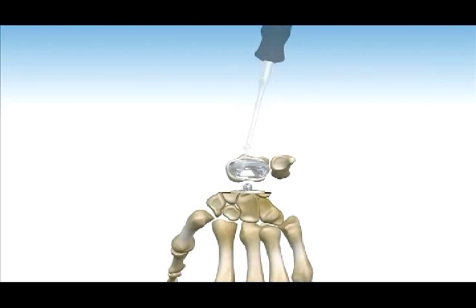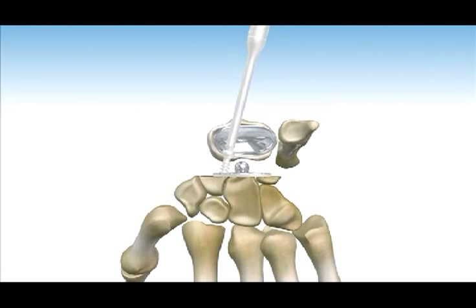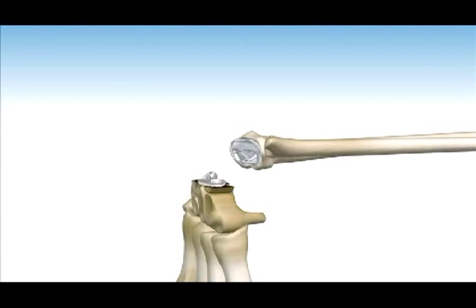The self-tapping screws are inserted through the carpal plate and into the holes created by the two millimeter drill bit with a 2.5 millimeter hex driver. Use imaging to determine that the screws are the correct length. The screws can cross the second carpometacarpal joint but not the fourth carpometacarpal joint. The screws are then tightened into place.